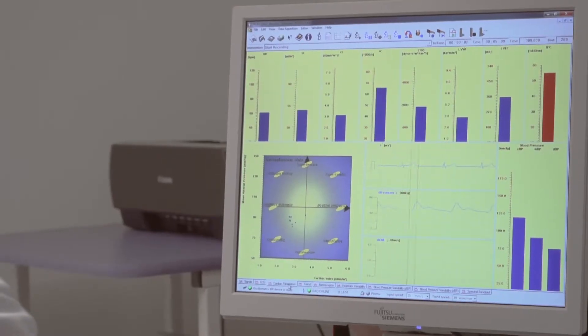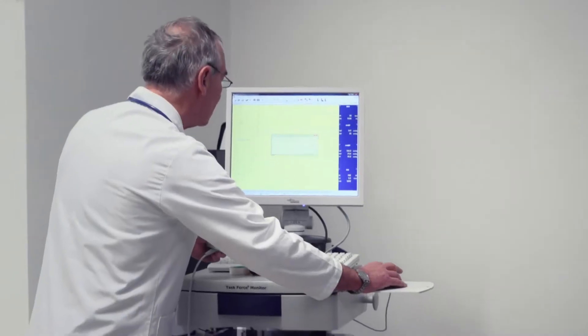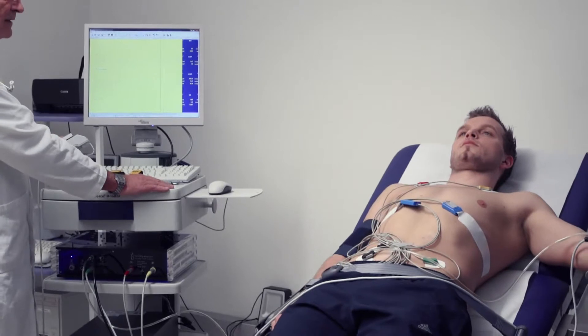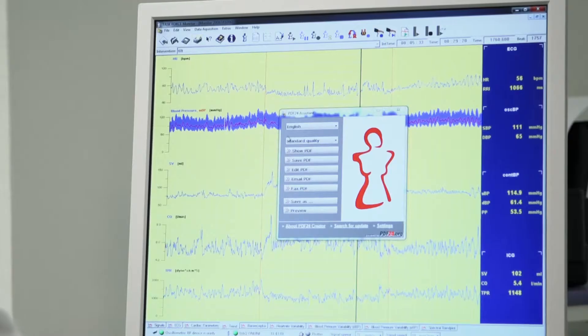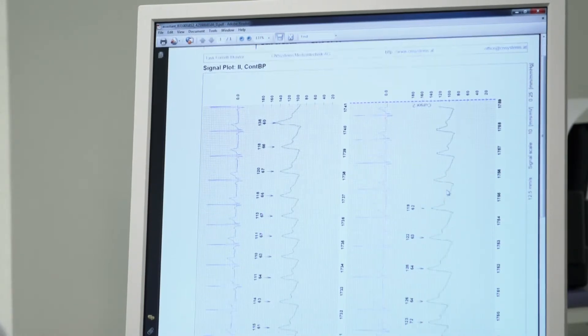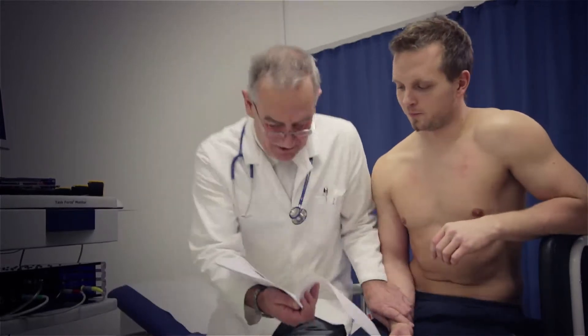Following a measurement with the Task Force Monitor is easy. All sensors and measurements are controlled automatically, and all parameters and graphs are displayed in real time. Stop the measurement when your data collection is complete, storing all patient data to hard drive disk. Print an ECG strip any time you need one, or generate a printed report at the end of the measurement with a single mouse click.